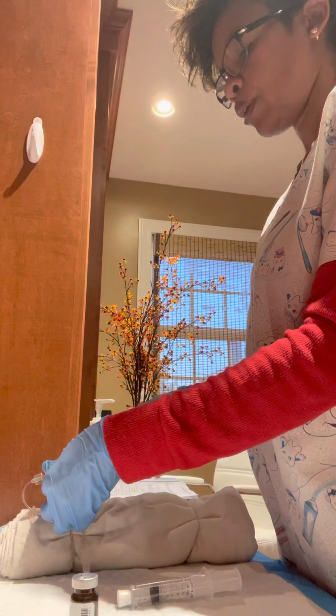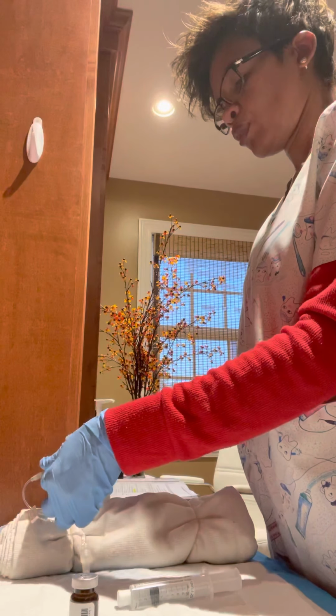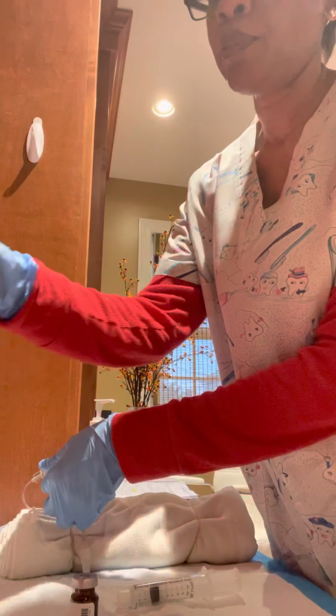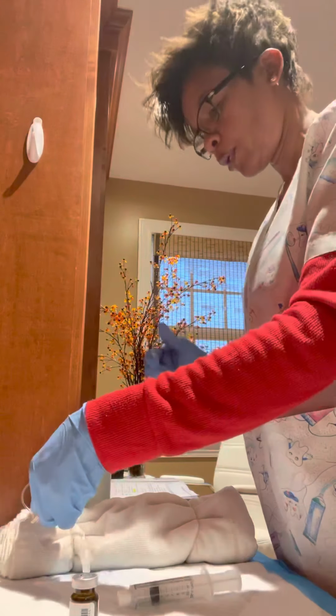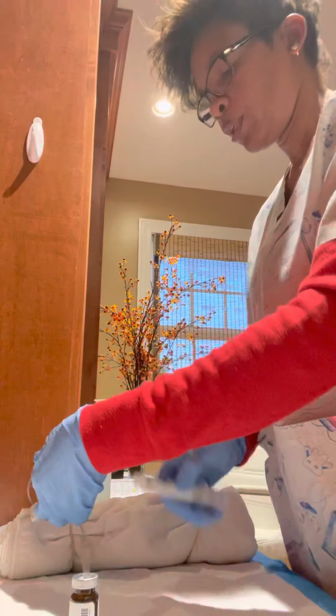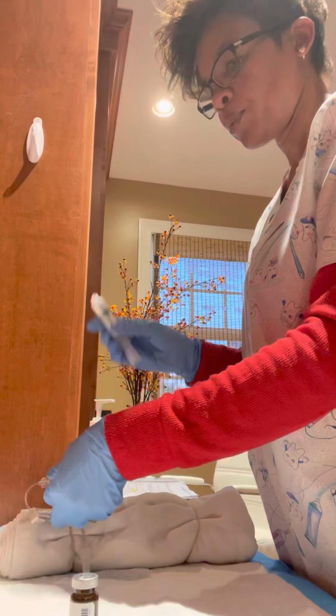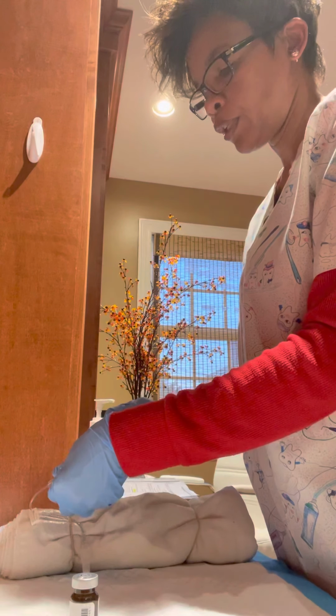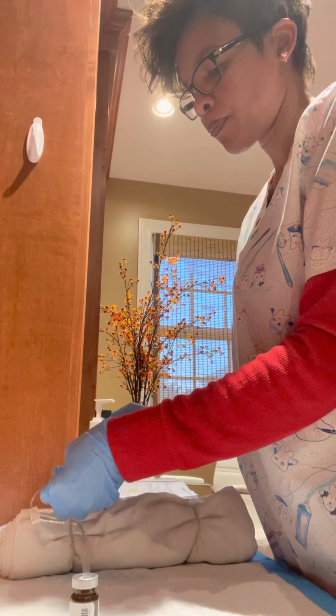So then I would just remove it, put it in the sharps. It's not sharp because there's no needle. I could have put it in the garbage as well. And then I'm just going to do another flush, 3 ml.